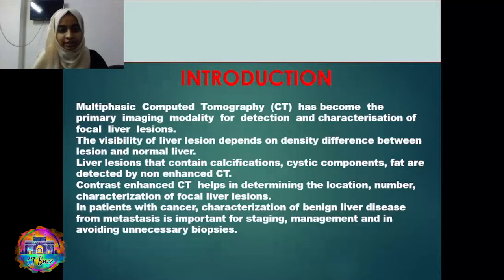Multi-detector CT has become the primary imaging modality for detection and characterization of focal liver lesions. The visibility of a liver lesion depends on the density difference between the lesion and the normal liver. Lesions that contain calcification, cystic components and fat are better detected on non-enhanced CT. In contrast, enhanced CT helps in determining the location, number and characterization of focal liver lesions.